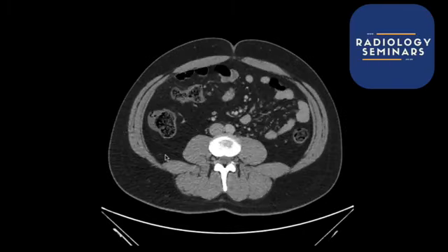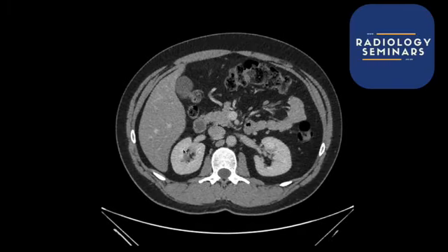The other point, and this is a really important point, is that sometimes people get really fixated on something. Let's say, for example, there was a lesion sitting right here. And you get so fixated on that lesion, you're thinking, oh, is that a hemangioma? Is that a cyst? And you start Googling away, what could this be, right?